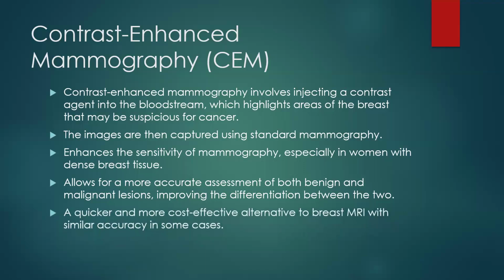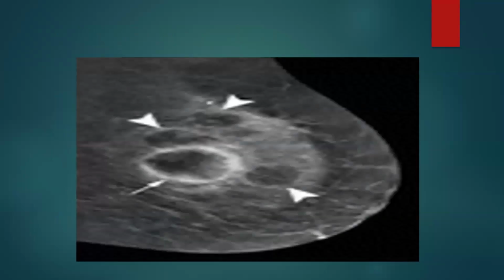It is a quicker and more cost-effective alternative to breast MRI, with all the waiting time and long lists for MRI, with similar accuracy in some cases. This is a case of contrast-enhanced mammography.